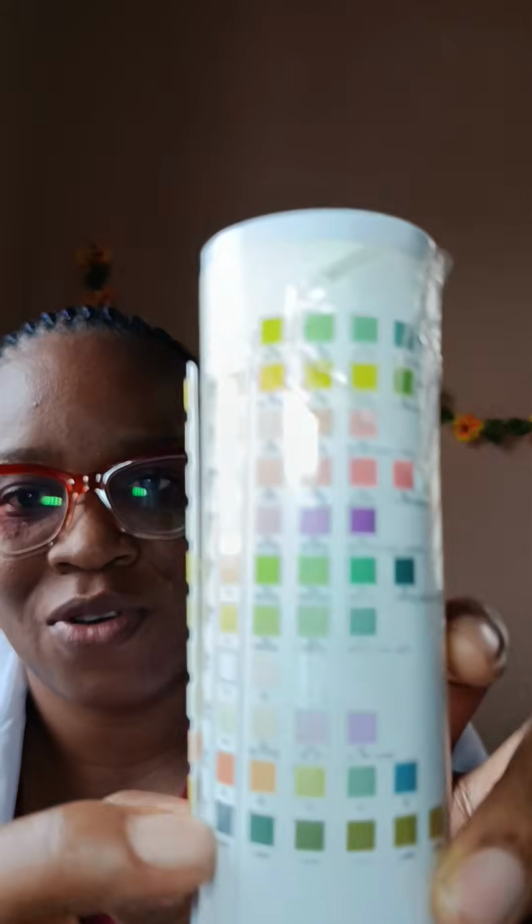This checks the specific gravity. It shows specific gravity with indication of different colors. It shows the pH. Different colors show different things, the different pH. We have leukocytes, which are the white blood cells. We have nitrites; it indicates nitrites. We have protein, and it shows whether it's +1, +2, +3. We have glucose; it also indicates glucose.